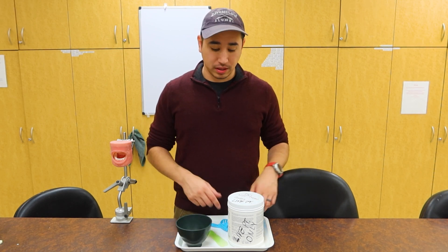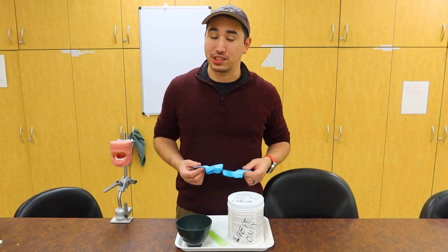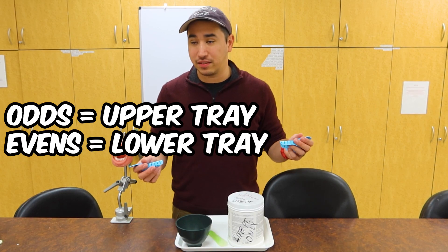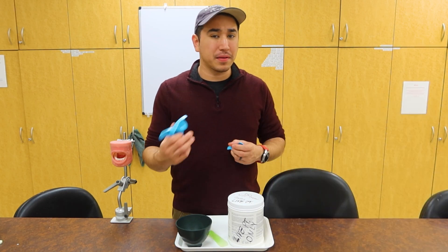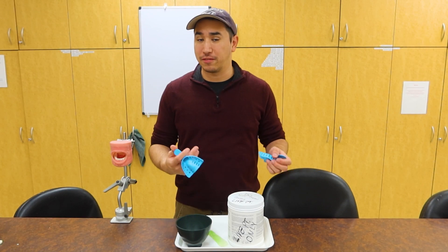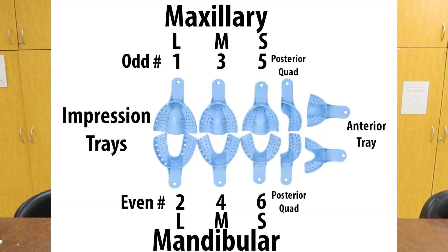Apart from our mixing equipment, we need to get our impression equipment. You really want to be impressive at getting your impression trays. We have a couple different sizes going from odds and evens, larges to smalls, making a custom form tray, or taking different quadrants or anterior regions specifically for whatever we might need. There are also metal perforated trays that fit the bill just as these do.